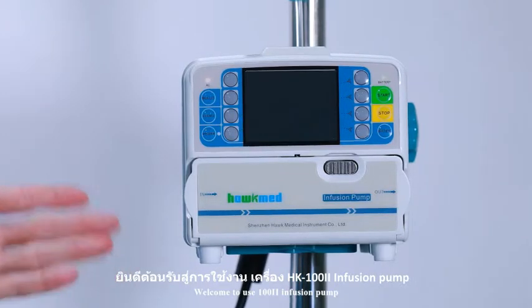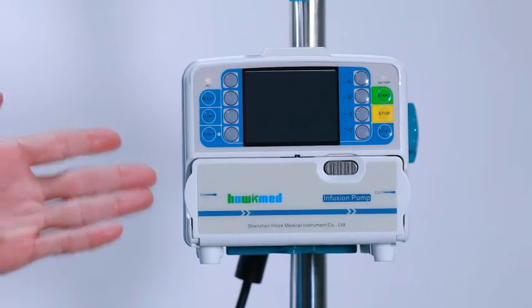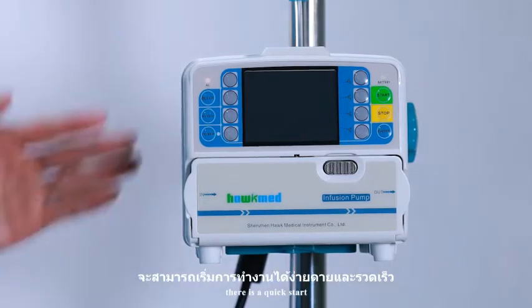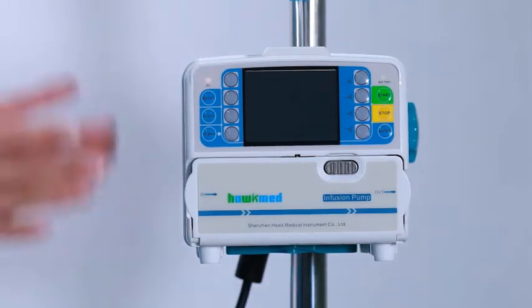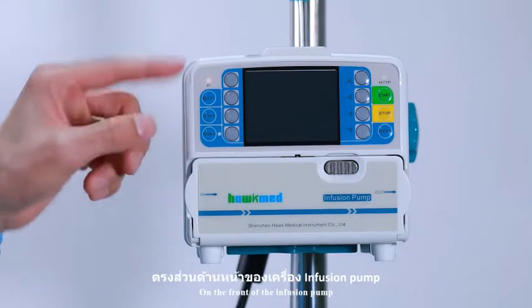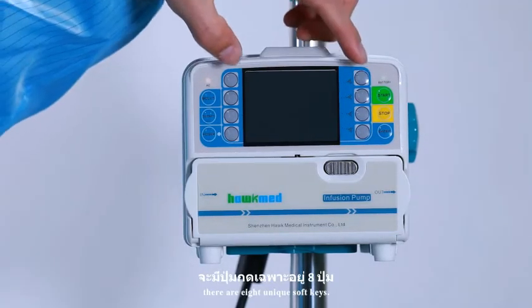Welcome to the use 100II infusion pump. On the left of the infusion pump, there is a quick start guide. Always go for quick reference. On the front of the infusion pump, there are 8 unique soft keys.